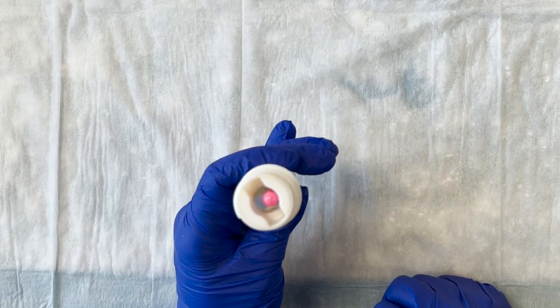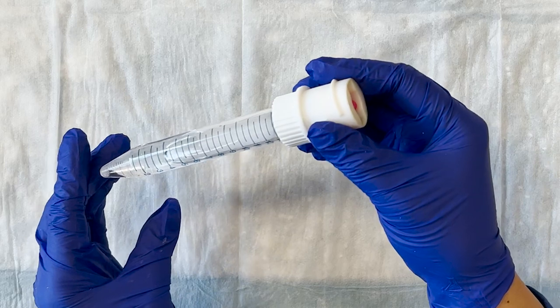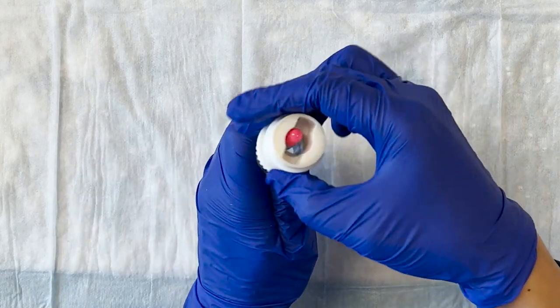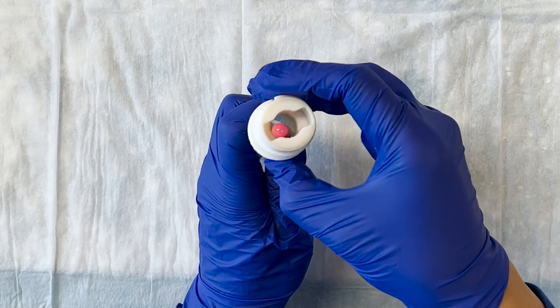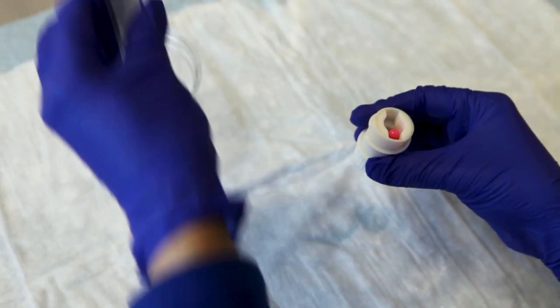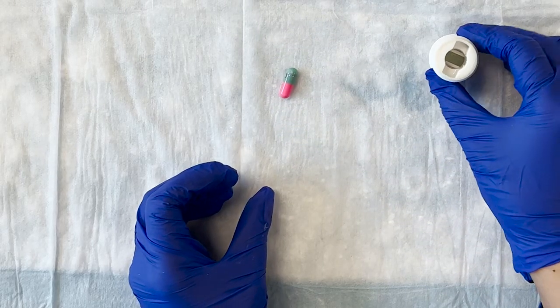If you have placed the capsule vertically, do not pull the capsule out in case it comes apart, and do not turn the liquid-filled device upside down, as this will spill some of the liquid. Instead, unscrew the adapter body from the tube of liquid. You can place this into the empty cup to keep it from spilling, and turn the adapter upside down to let the capsule fall out.